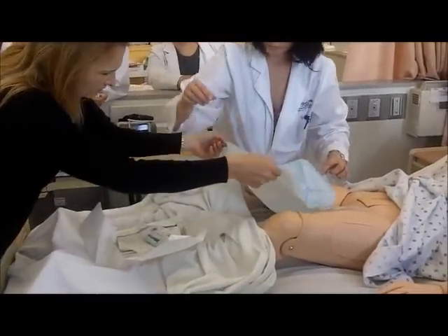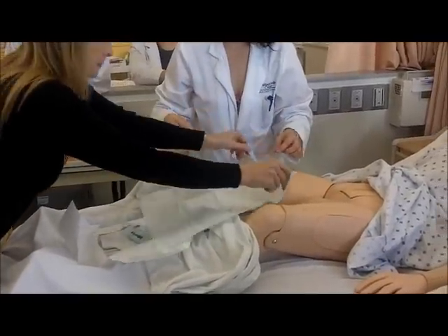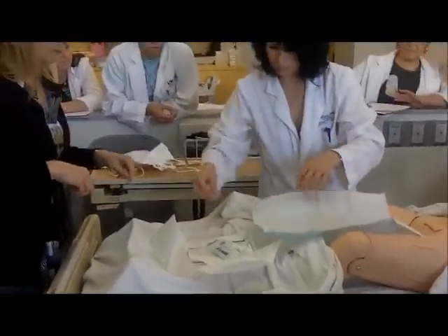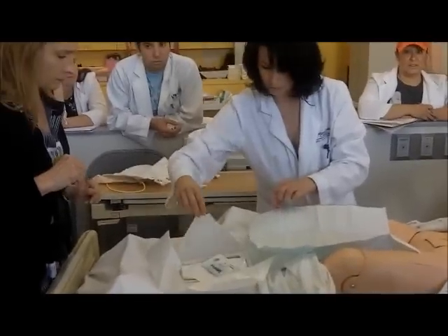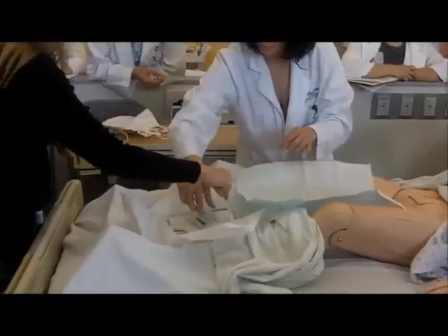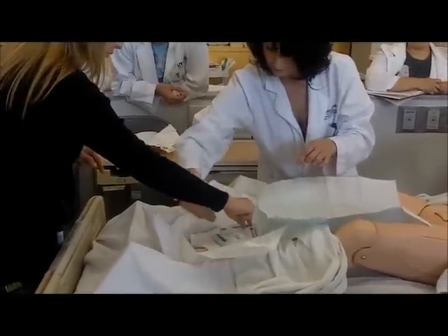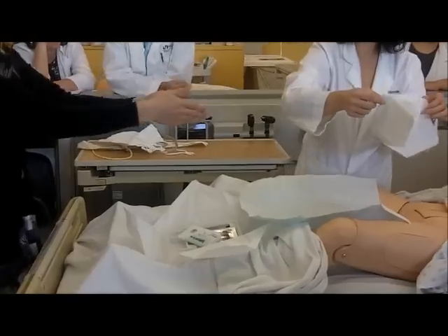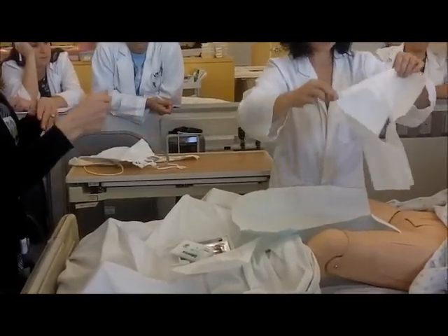Is that shiny? Is that shiny? I'm blue shiny. Grab that one. That hand is supposed to touch. Touch the end. And it's going on the stomach. And that goes shiny side down.